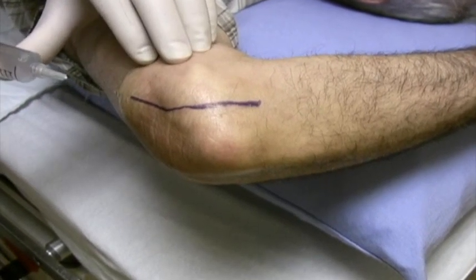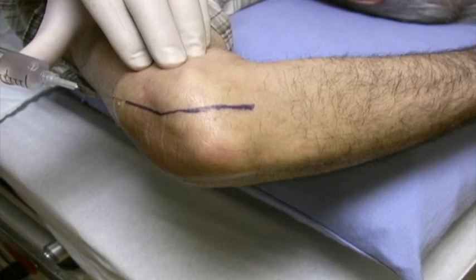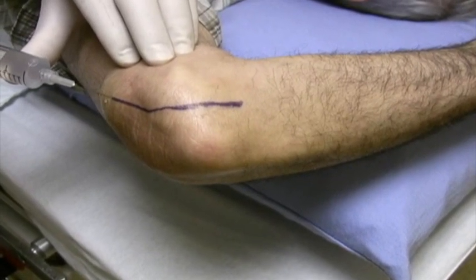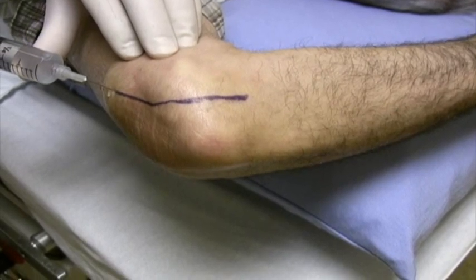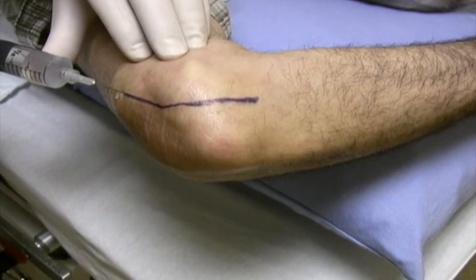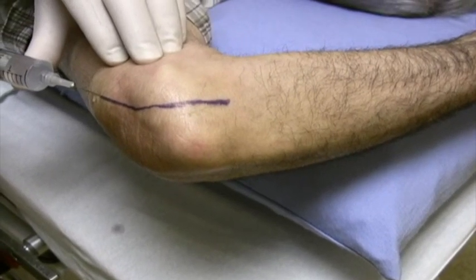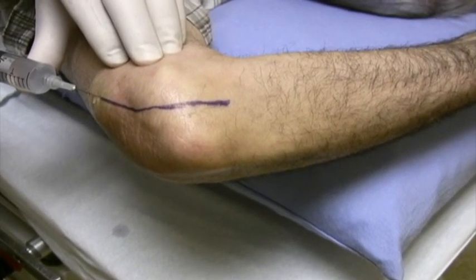So now I'm going to go right here because I know that that should be a safe zone. He's going to tell me if it is. Did that hurt at all? No. So far, how are we doing up here in the elbow? The first poke, or did you feel any other pains? No, that's the first little poke. I wasn't mad either. Oh, that's good.